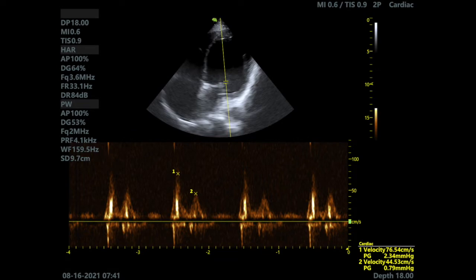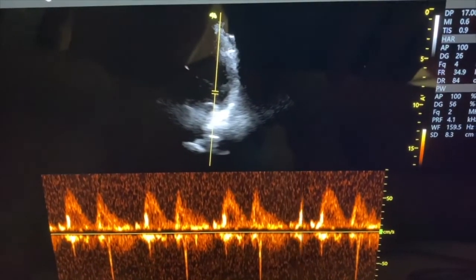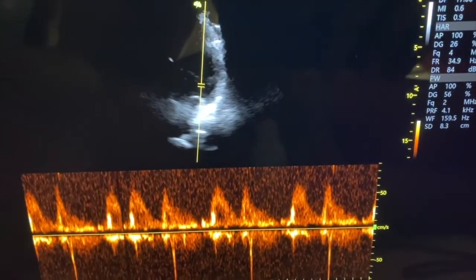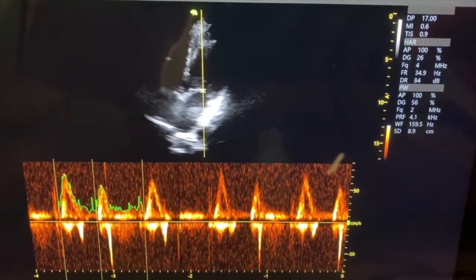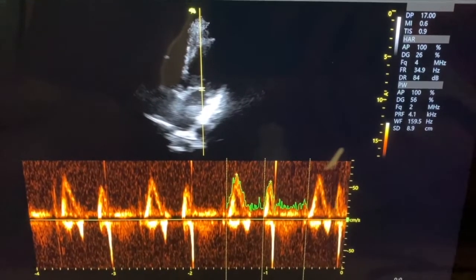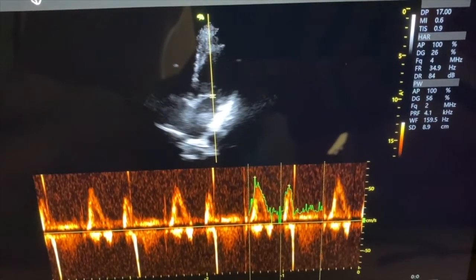And now let's hear the sound. It has a lot of Doppler measurements and settings — for example, this auto-tracing tool that detects the cardiac cycle and the peak velocities. And now that we've seen the mitral valve, let's see the aorta.